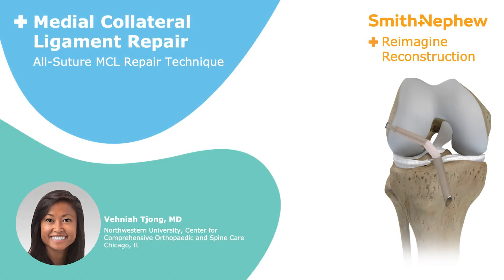This video demonstrates an example of a distal MCL repair using the QFIX all-suture anchor device in a double row technique.